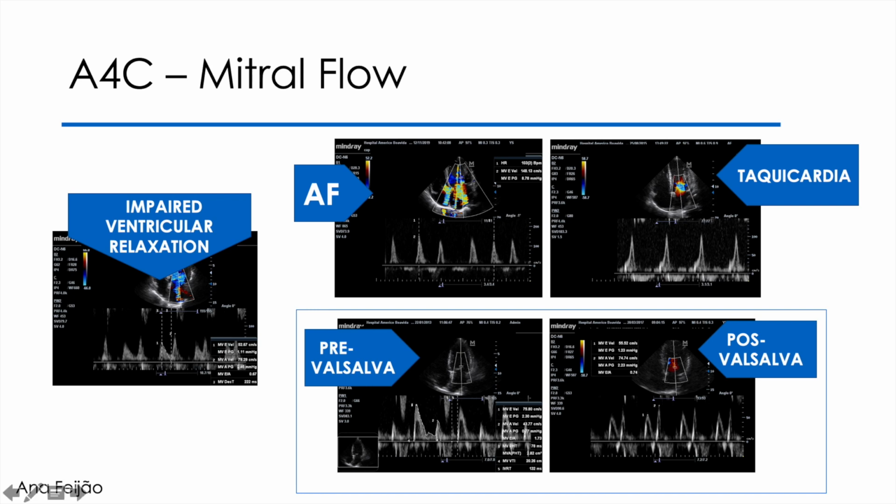In these cases, it is important to correlate it with other diastolic parameters to confirm whether it is a degenerative change in the heart or whether we are experiencing a case of mild diastolic dysfunction. In the case of a patient with sinus tachycardia or with some type of atrioventricular block, there may be fusion of the A wave in the deceleration ramp of the E wave. In these patients, deceleration time should not be measured.